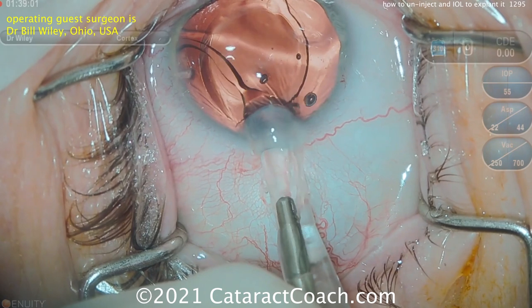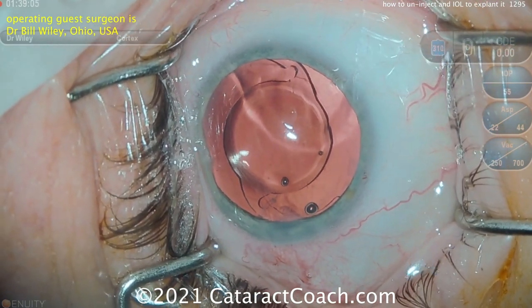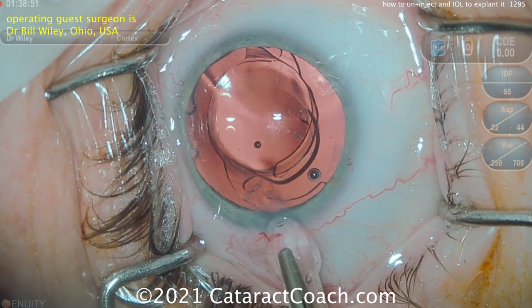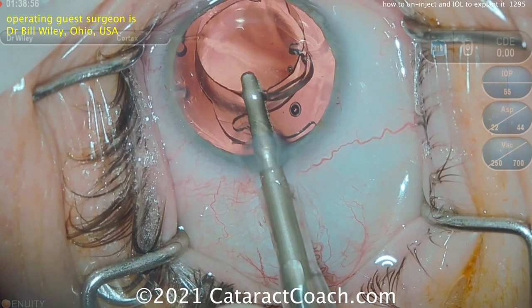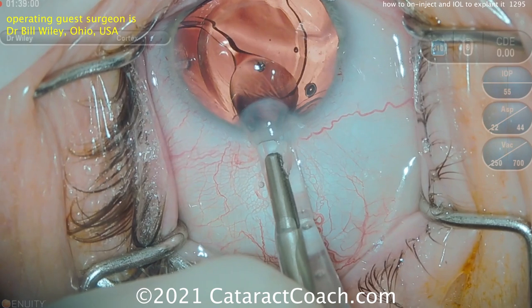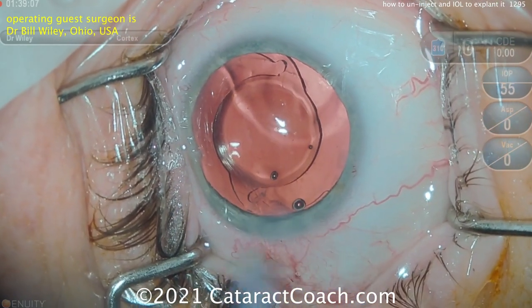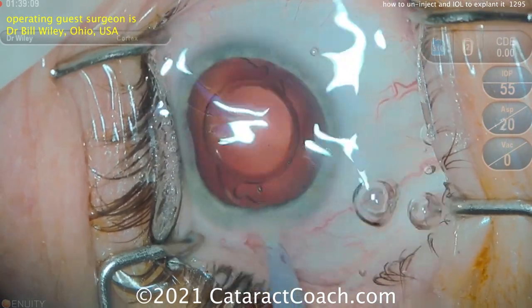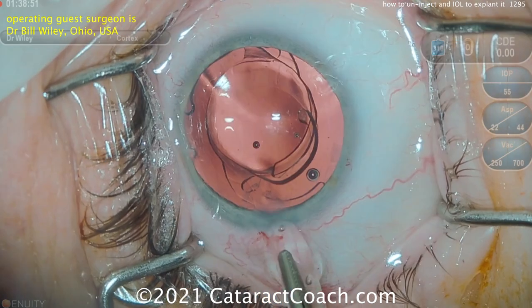He essentially un-injects it — the lens folds up on itself and he can pull it out of the eye just like that. Let's watch it one more time: grabbing the optic edge and just pulling. There's an empty lens cartridge there to help create a tunnel or passageway to guide it out of the eye, and then the rest of the case — removing the viscoelastic, etc. — is pretty straightforward.